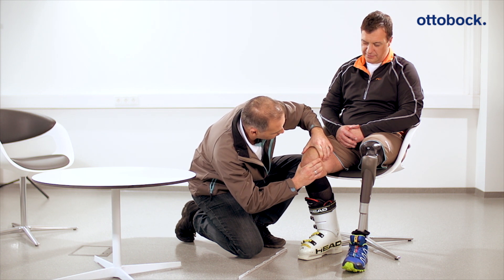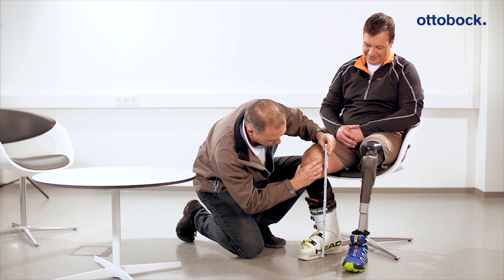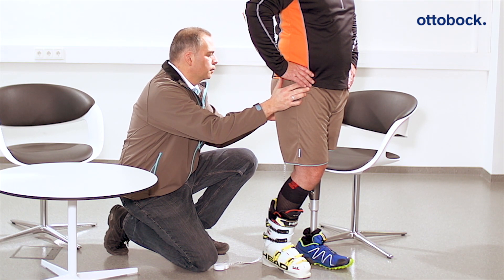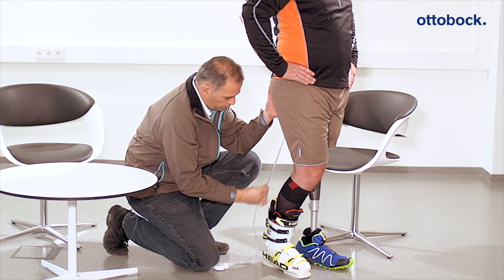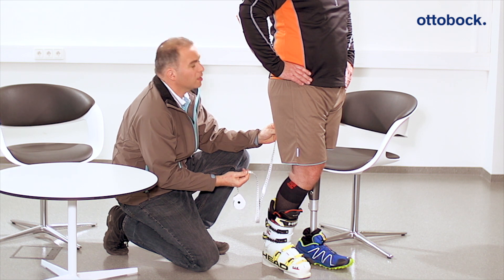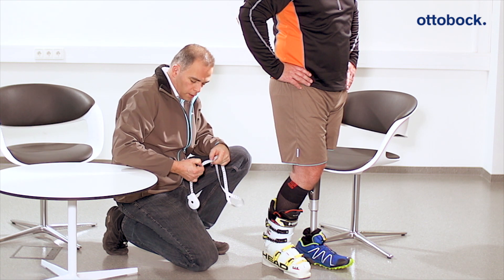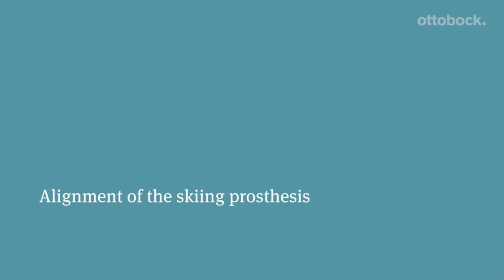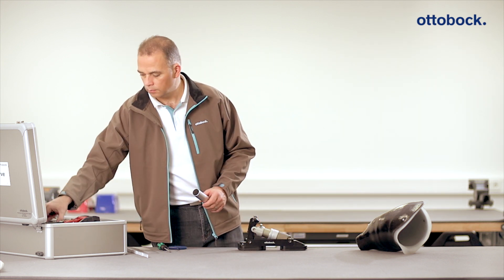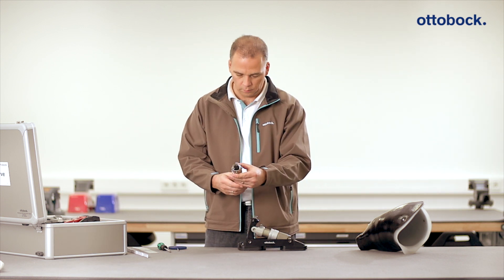The correct medial tibial plateau to floor measurement for the patient should be determined on the intact side with ski boots on, while the patient is sitting. The ischial tuberosity to ground distance should also be measured with the ski boot on. It is advisable to reduce the prosthesis length by three to five centimeters at the beginning so as to have better control while skiing. Once these measurements are determined, the bench alignment of the prosthesis begins.